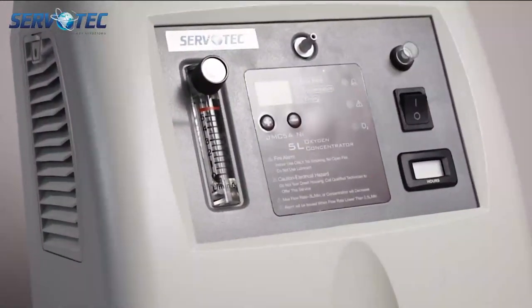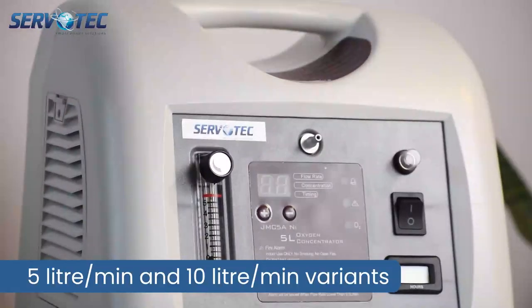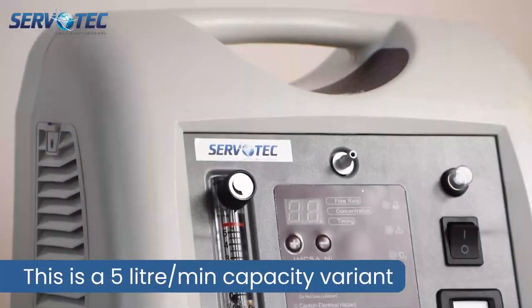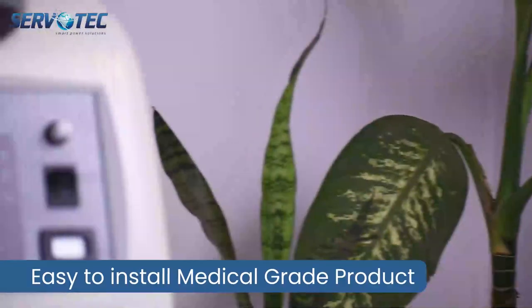ServoTec Oxygen Concentrator. It comes in 5 litre per minute and 10 litre per minute capacity variants. It is a very easy to install medical grade product. Here are the steps.